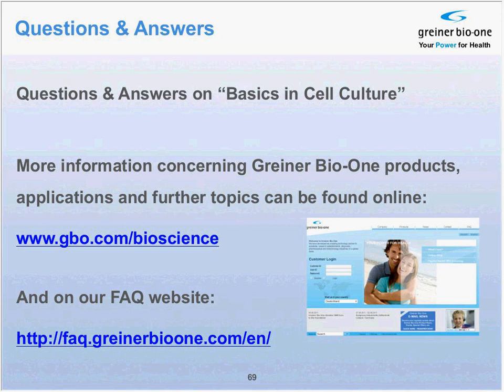Okay. Last few here. Is there a difference between 70% ethanol and 70% isopropanol as far as effectiveness for cleaning surfaces? Basically, no. I've read reports that say that isopropanol might even be a bit more effective than ethanol, but actually it doesn't matter. Ethanol would be just fine because it's used in hundreds of millions of labs worldwide, and so you just go with that.